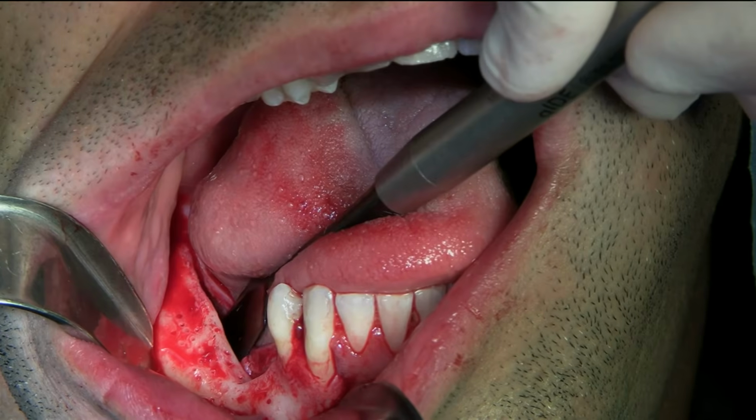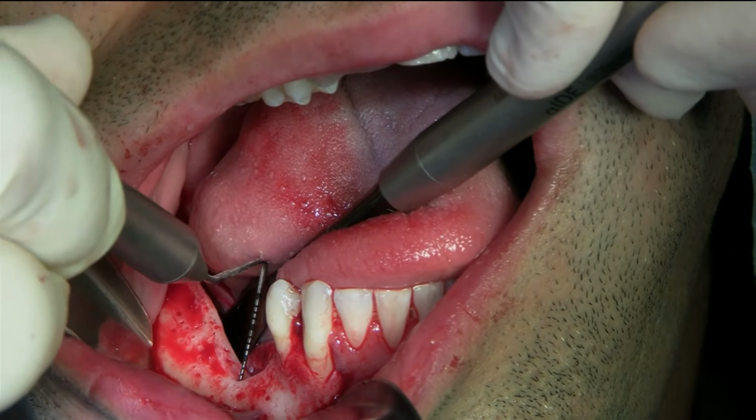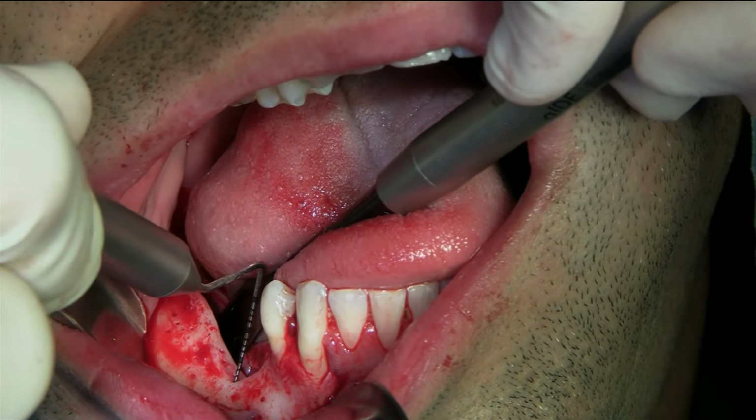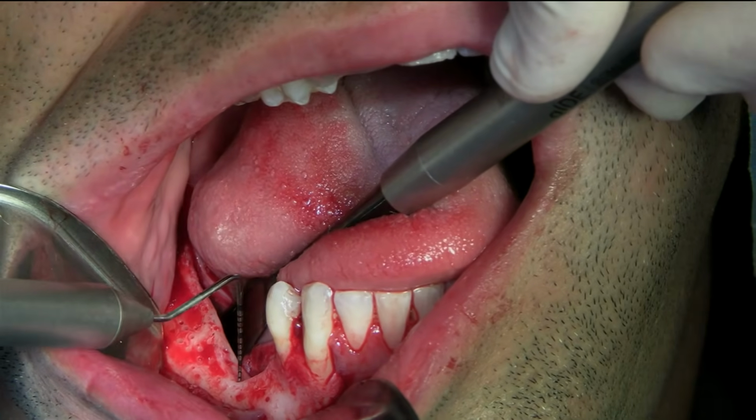I made a bunch of perforations in the crest where the defect is, so I can use this one here as an entry. And I'm just looking at the vertical.